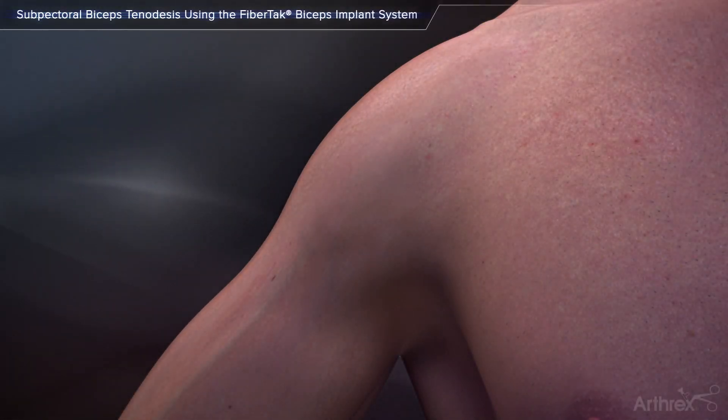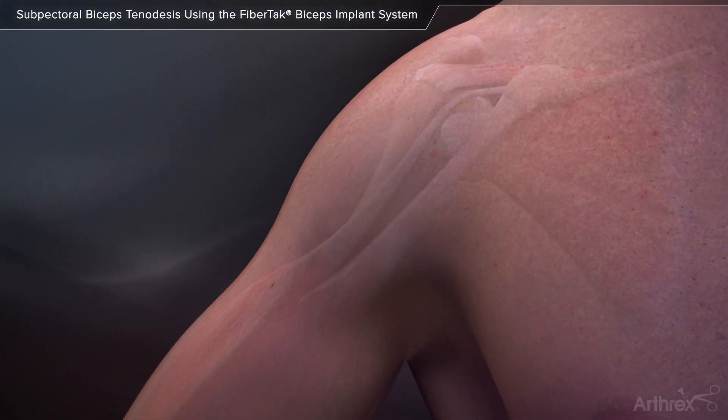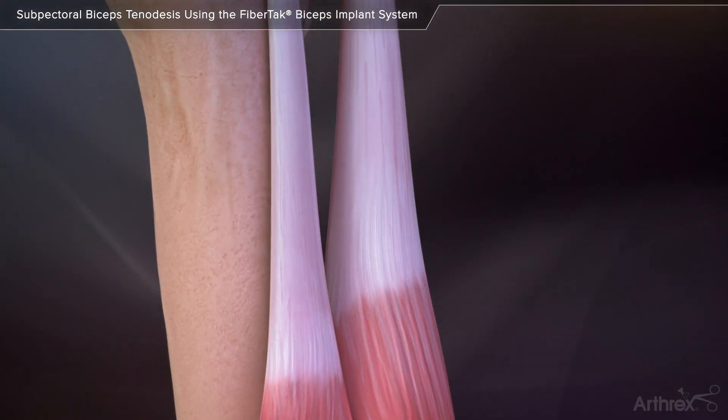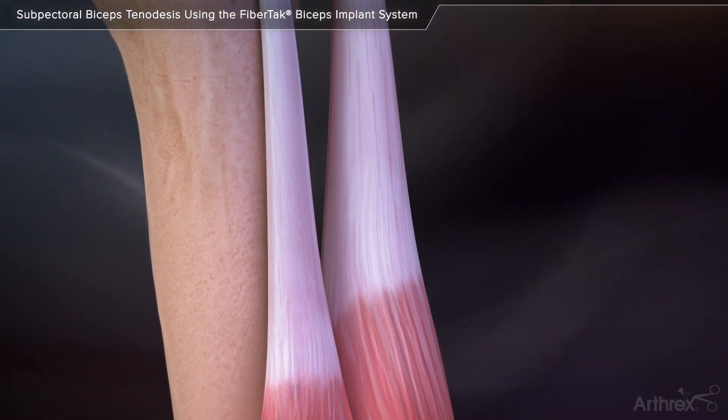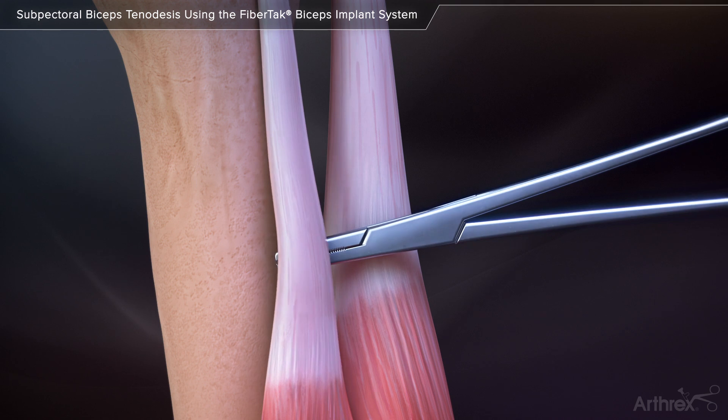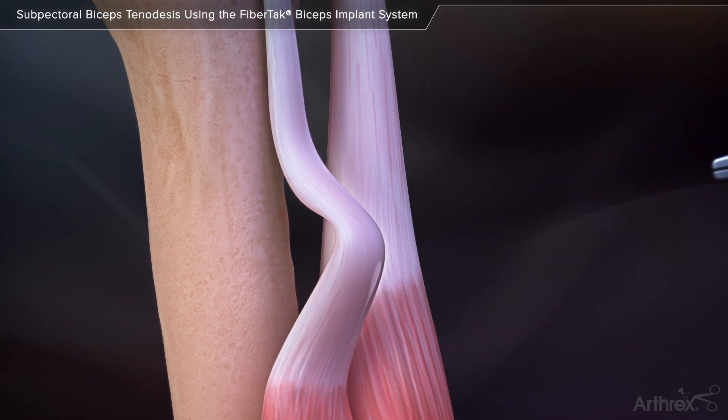Subpectoral biceps tenodesis using the FibreTac biceps implant system. Make a 2-3 cm incision in the axilla at the inferior border of the pectoralis major. Bluntly dissect to identify the pectoralis major and the long head of the biceps tendon. Retrieve the previously tenotomized biceps tendon through the incision.